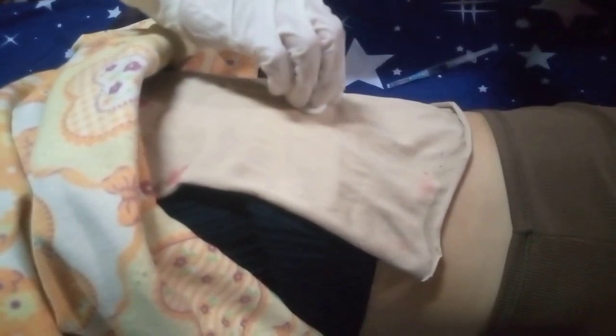And now, disinfect the injection site in a circular pattern from inner to outer for about 2 inches.